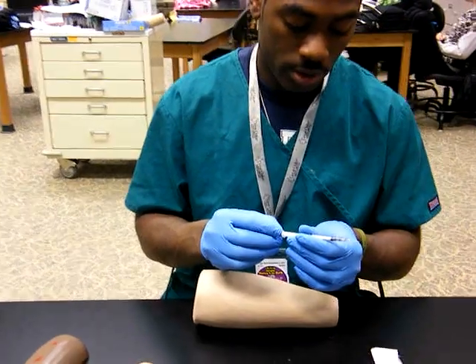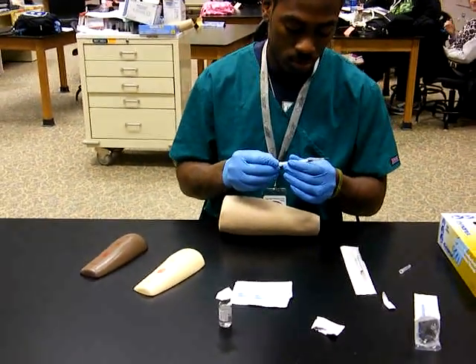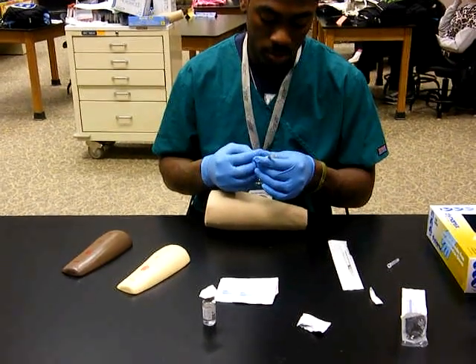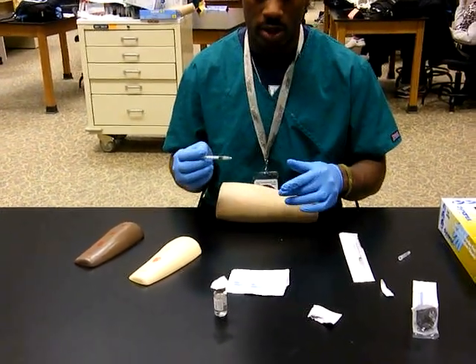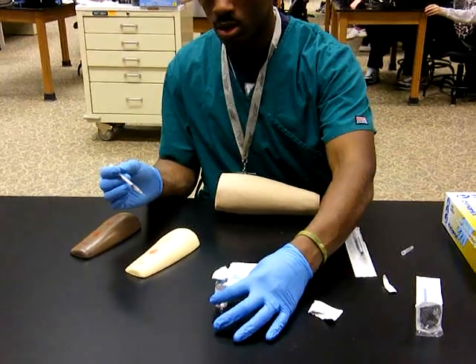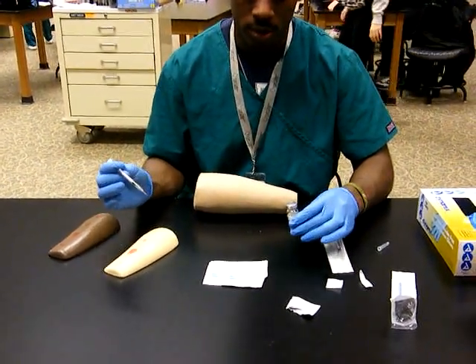You pull back how much you would need. Say you're putting in 0.1 — you do this before you stick it inside of the medicine bottle. You look again to make sure that you are getting the right one. It's already been wiped off.